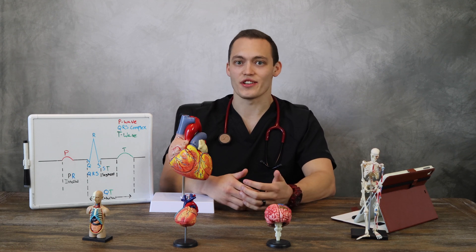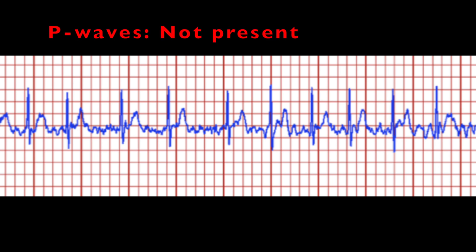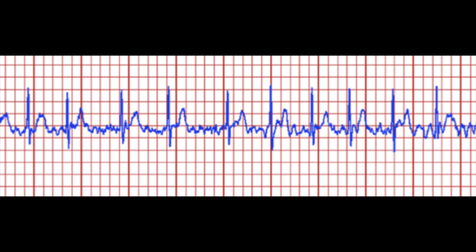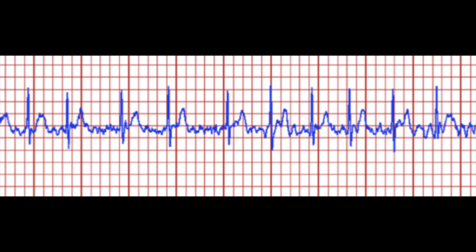On an EKG strip, atrial fibrillation will not have P waves, and that's because of the chaotic activity occurring in the atria. Another important thing to remember about AFib is that since there are no P waves, there is no PR interval. If you remember how the heart beats, atrial contraction is followed by ventricular contraction.